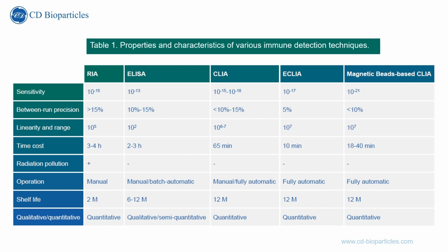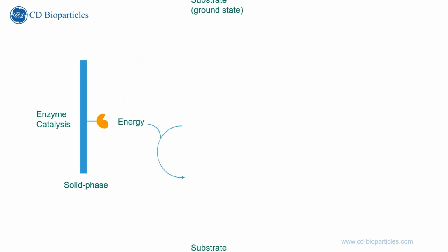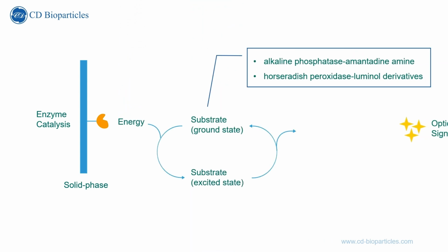A new, faster technique has been developed which has transformed the field of biological and chemical detection. Chemiluminescent immunoassays, short for CLIAs, are based on the detection of a protein that emits light in a chemiluminescent reaction. No stop reaction is required, and incubations are short. CLIAs have a much wider detection range than either RIAs or ELISAs and are also extremely sensitive under low analyte concentration conditions. Chemiluminescent immunoassay was developed in the late 1970s.